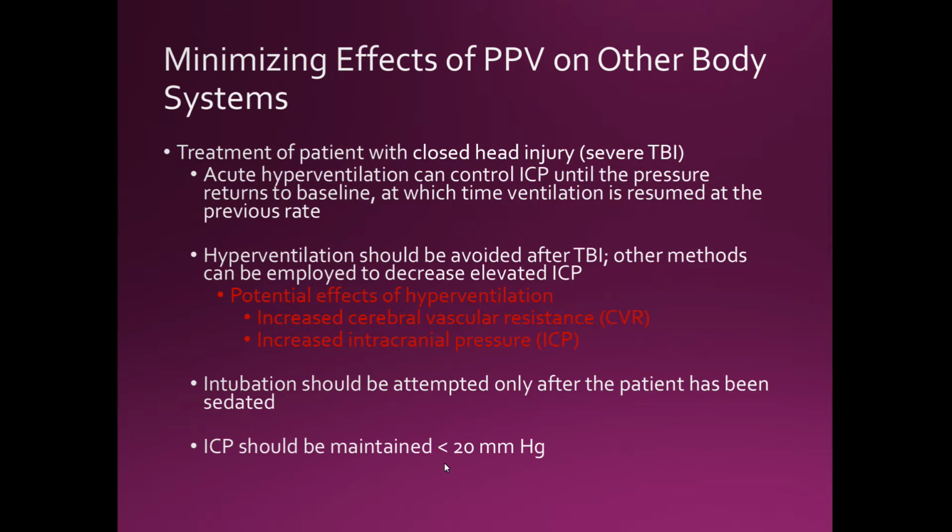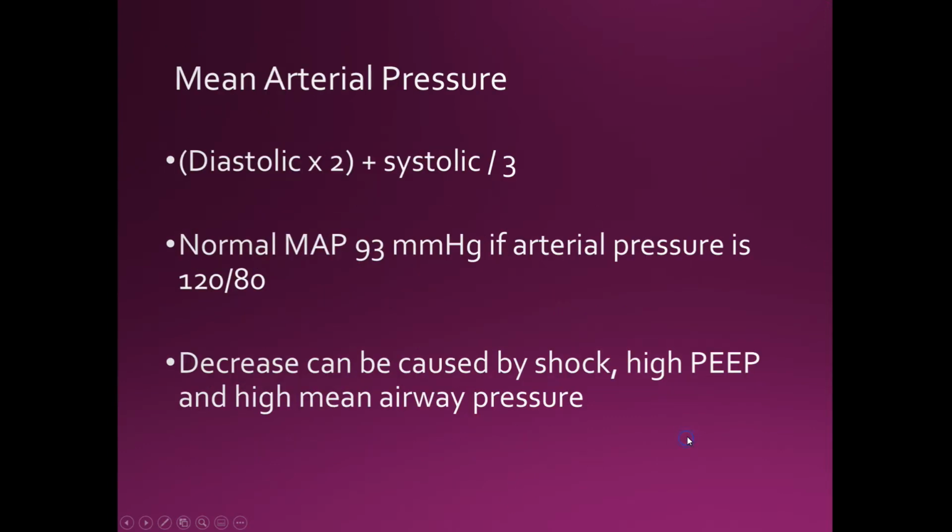The neurosurgeons are going to put it in the skull, and it's kind of like a tube sticking out of the head. It's a really small tube, and we can clamp it, and it blends with hair, so aesthetically it's not going to be appalling for the patient. But it's there, and we can drain some intracranial fluid if the pressure is starting to increase.